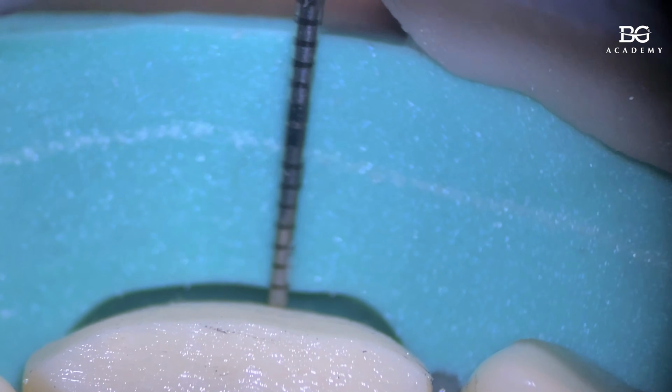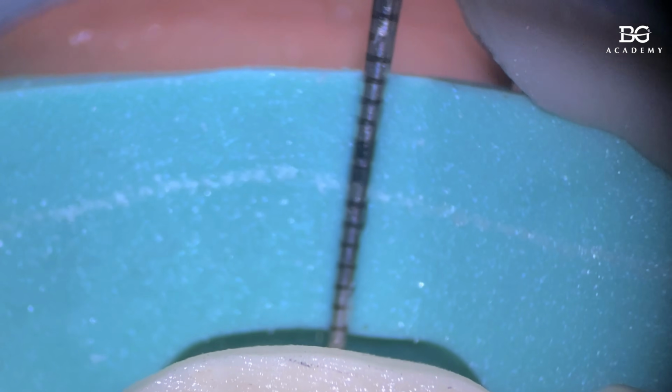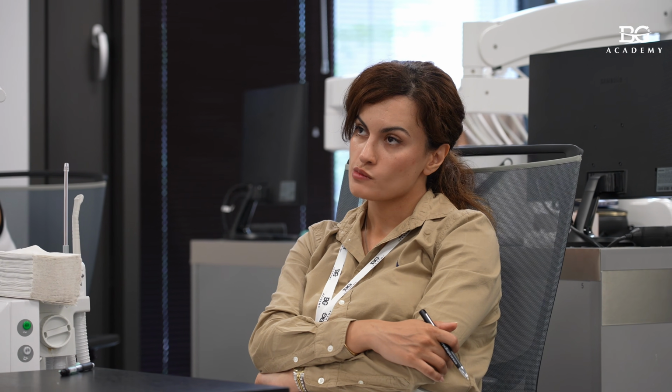Here in the cervical area, we have a bit, it's almost 0.5, almost, yeah, you can see here. Let's say 0.4 up to 0.5. I'm happy with that. There is no over-reduction. If it will be 0.7 or 0.6, I'll be sad.